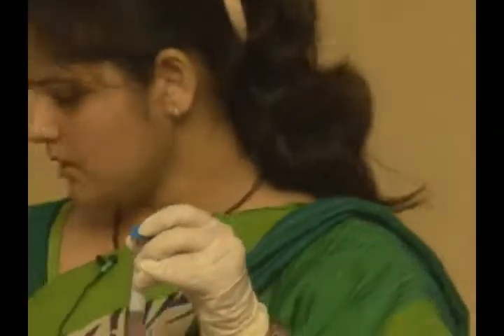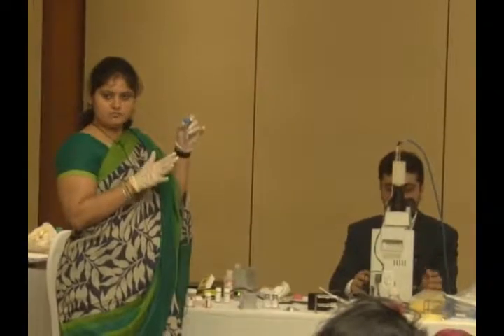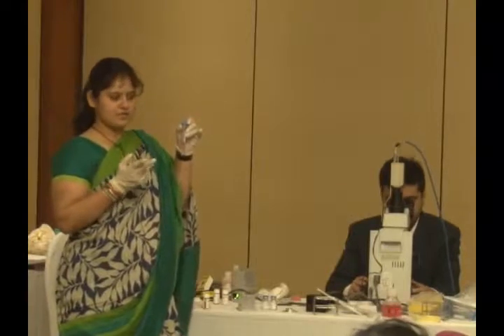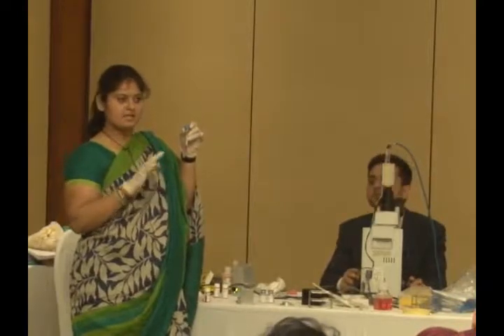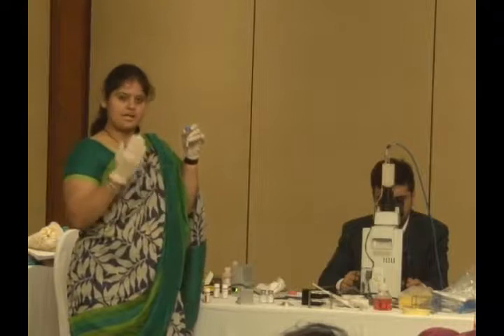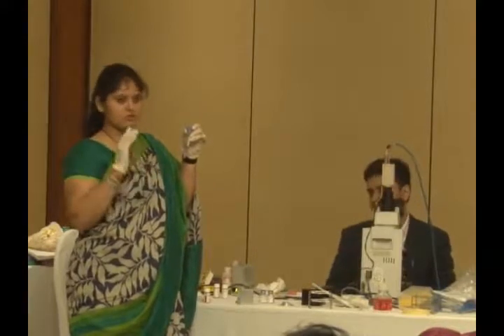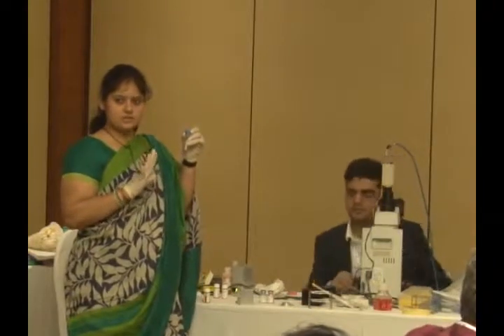Now we need to change the tube. We remove the supernatant, transfer the pellet into the next tube, add sperm wash medium, and centrifuge it again for 10 minutes. We have to give 2 centrifugations. The reason is that we use silica particles when we do the density gradient, and as sir mentioned, they can cause damage to the cervix. That is why we have to get rid of those silica particles. For that we give 2 washes with enough medium. If you don't use good quantity of medium, you will still find silica particles in the sample, and that can cause uterine contraction.